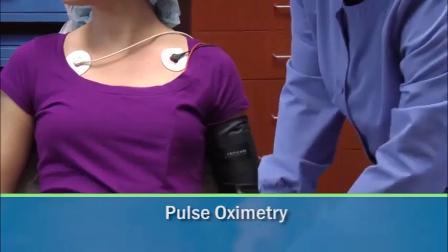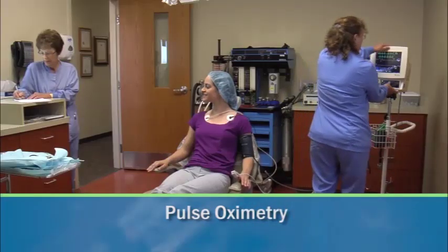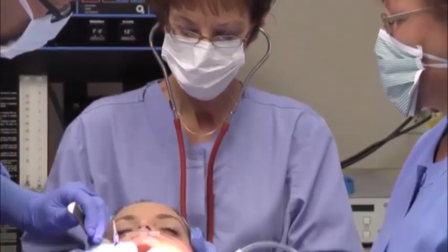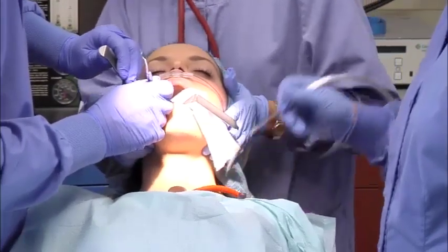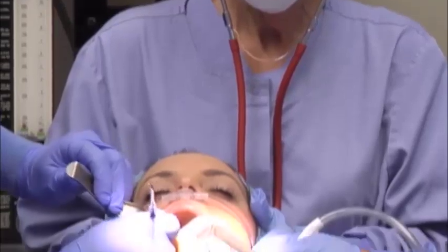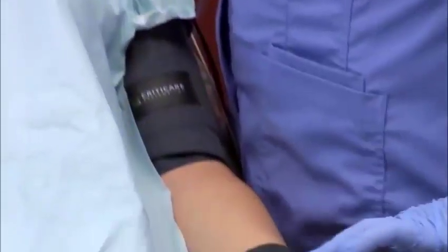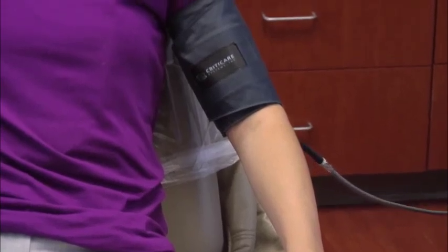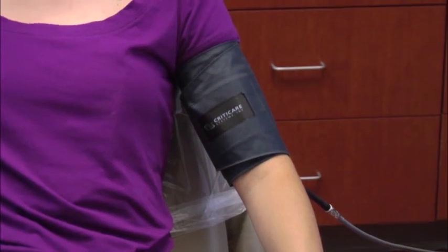Pulse oximetry is considered the standard of care for evaluating the patient's oxygenation during anesthesia delivery, from moderate sedation to general anesthesia. In addition, the team continuously observes patient color, including the skin, mucous membranes, blood, and nail beds. The team can observe the cardiovascular status of the patient by the use of a precordial stethoscope, palpation of pulse strength and rate, and the use of a manual blood pressure device. To assist the team's observation, automatic blood pressure machines provide sequenced or emergent readings. The BP readings should be a part of the permanent record.